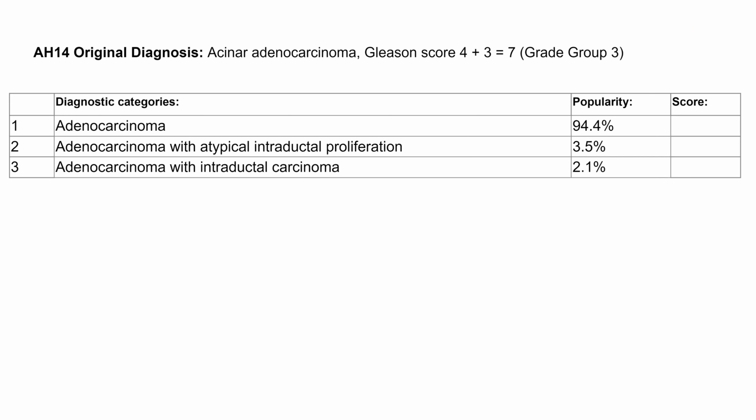It's just whether that quite strict diagnosis of the cribriform entity applies, of whether they're closely approximated. Typically in a cribriform, you wouldn't expect that bilayer between them, because they could just be two very closely opposed glands. I think there's definitely pattern 4 in that picture that I showed. It was just those bilayers, thinking about whether you'd call it cribriform, being another adverse prognostic factor independent of the Gleason grading. So that's probably going to be one of the dataset items that's going to come in, whether there's cribriform in that pattern or not.